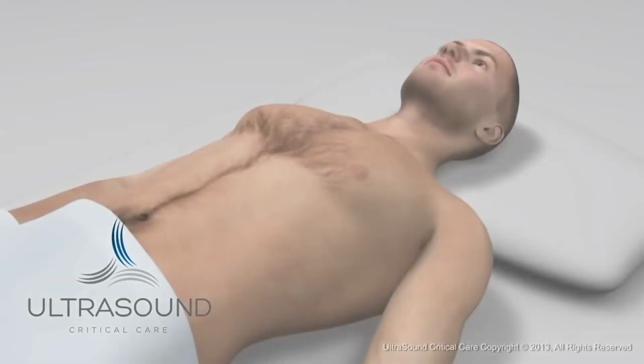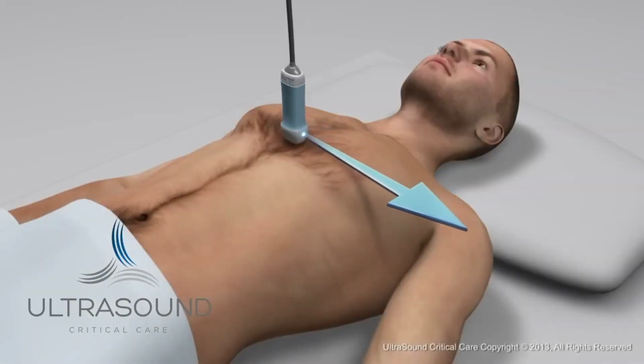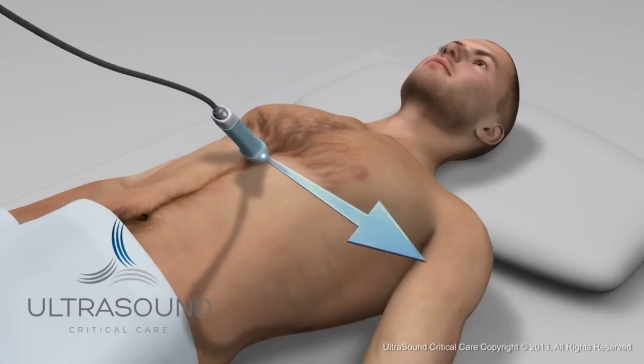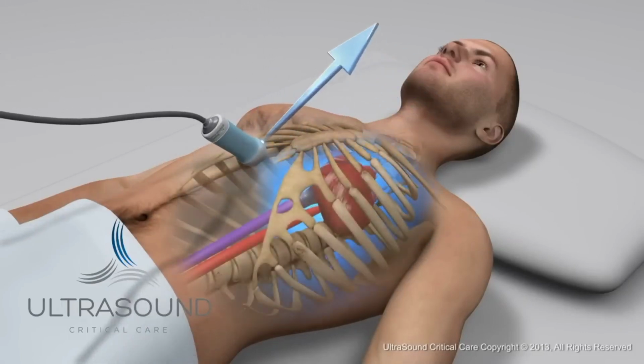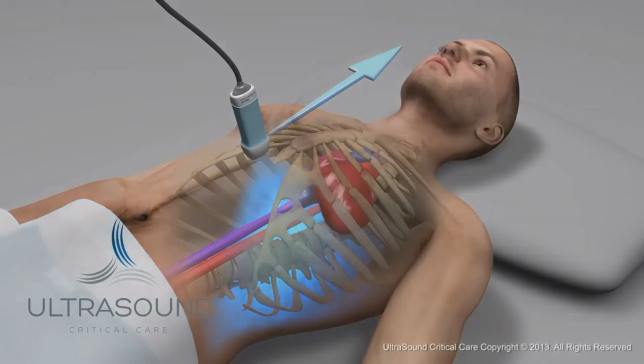The inferior vena cava. To obtain the IVC view, begin with the subcostal view and narrow in on the right atrium. Turn the probe counterclockwise until the dot is facing the patient's head. Slightly tilt the probe to the patient's right to bring the IVC into view.